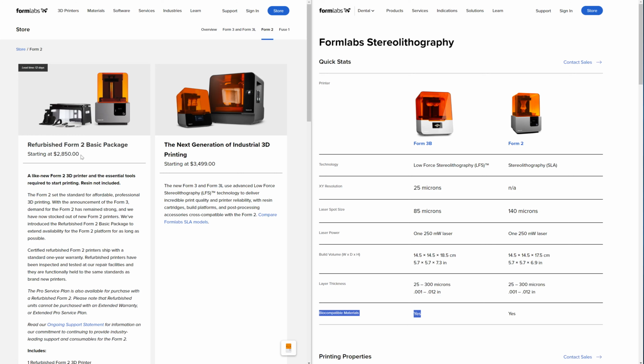It's not very expensive. If you know how much a dental lab charges for a surgical guide, you can get your money back very quickly. This cost is a low barrier, the way I look at it. If you don't mind spending another $1,000 to get the latest and greatest technology, that's definitely up to you. It sure is the latest thing, they just came out with it literally a month ago, but in my opinion, will it really make a difference in the quality of your surgical guide, such that the guide from 3B is going to lead to a better implant outcome?